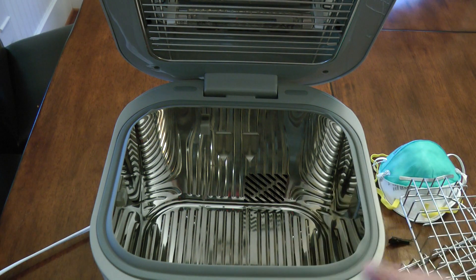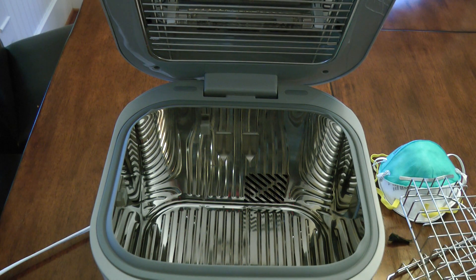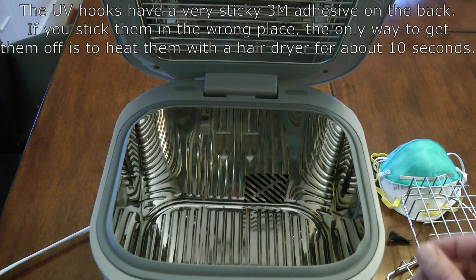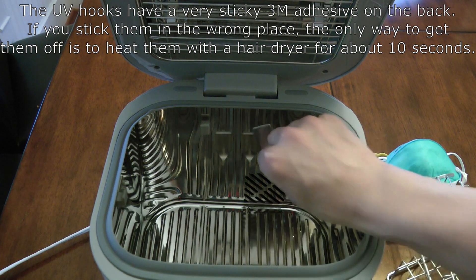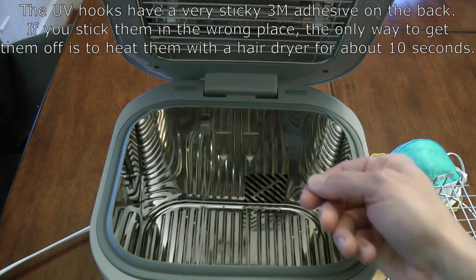So I'm going to show you the location of where these hooks go and give you the dimensions — I'll put it in the video — so when you put yours in, you don't have to figure it out yourself. Now, one thing to note: it's very easy to place the hooks and accidentally stick them in the wrong spot. If you place them gently while making your measurements, you can pull them right back off and replace them. But if you stick them with any force at all, they'll stick against the wall of the chamber and will not pull back off.